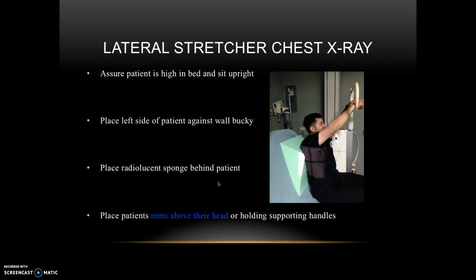This is a lateral stretcher chest x-ray. So again, the patient cannot stand. We're going to be performing a lateral chest x-ray on the stretcher. We're going to assure that the patient is high in bed and sitting upright. So you see here, we're going to place the patient's left side against the wall bucky. So this patient's left side is against this wall bucky here.